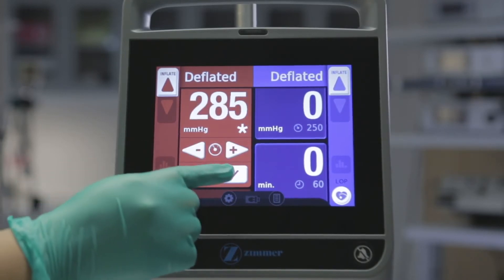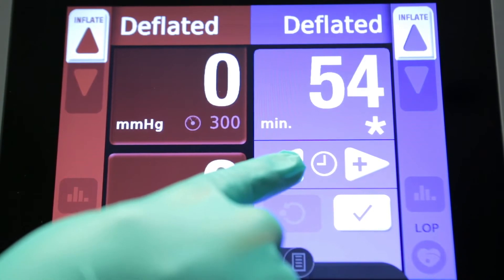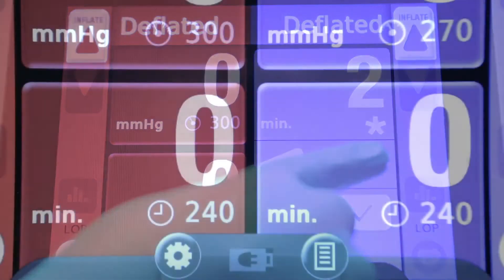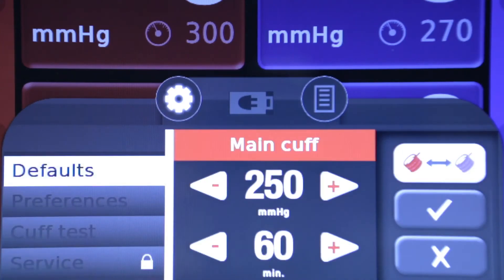Tap the OK button to confirm the setting. The time tile functions in the same way — tapping the tile shows the current time setting, and the arrows can be used to adjust the time from 1 to 240 minutes. To change the default pressure or time setting, tap the settings icon on the bottom of the screen, then tap the default menu button. The factory default pressure setting is 250 mm of mercury and the default time is 60 minutes.